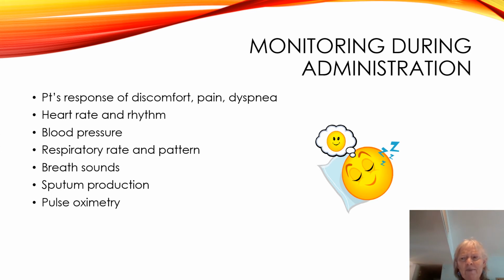And what you ask them is, why are you doing that? And they'll tell you, well, the faster I breathe, the faster I'll get it done, and then I don't have to do it anymore. Unfortunately, the faster you do it, the less effective the treatment's going to be. So we need to talk with them and tell them, there's no prize for first place. You need to slow it down a bit.